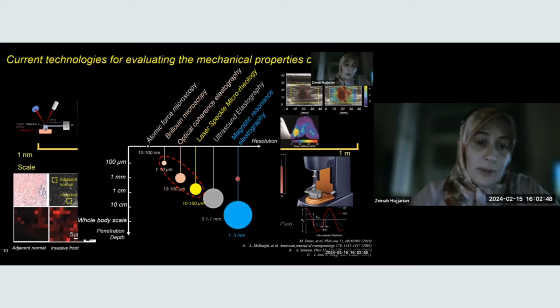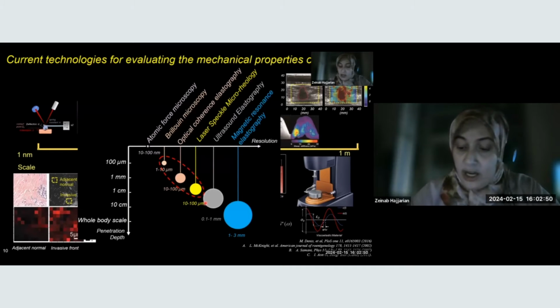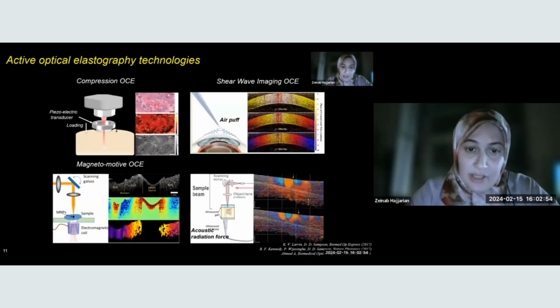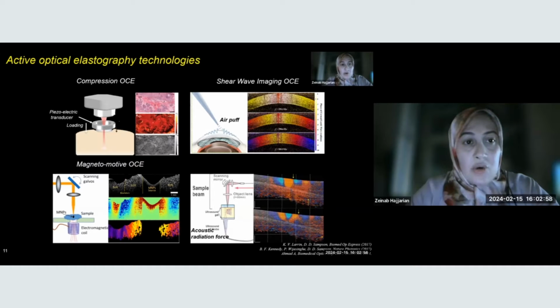Good examples are different varieties of optical coherence elastography, elasticity imaging modalities developed based on the parent technology, optical coherence tomography.